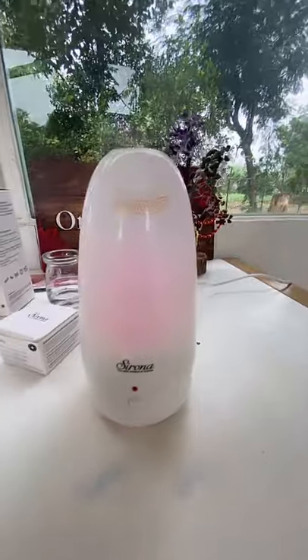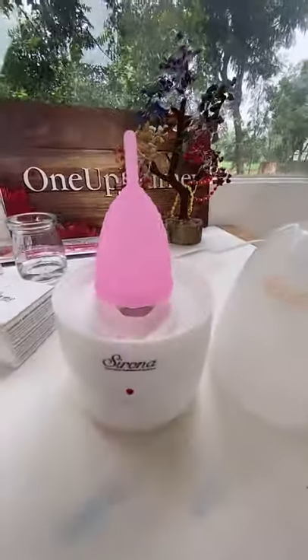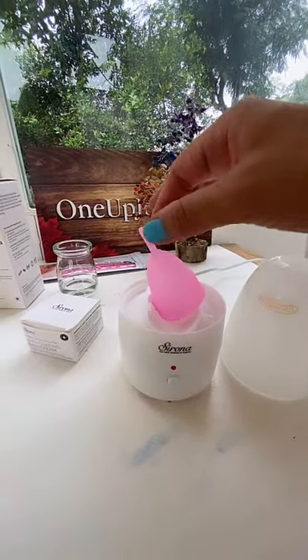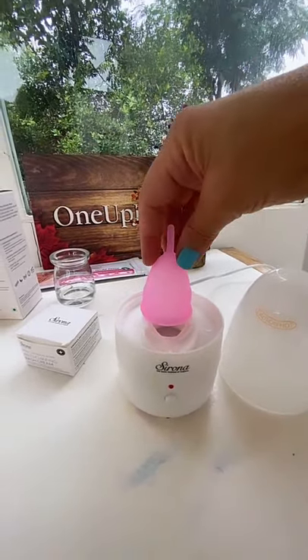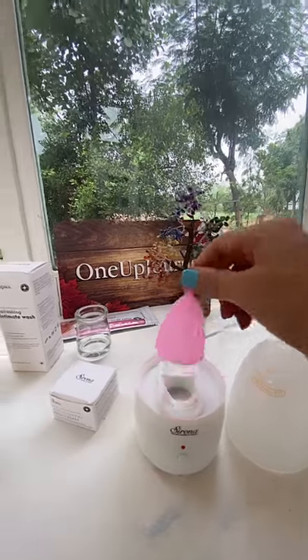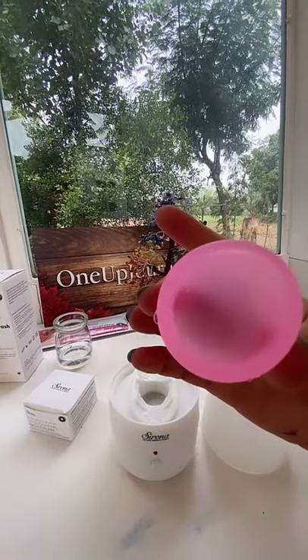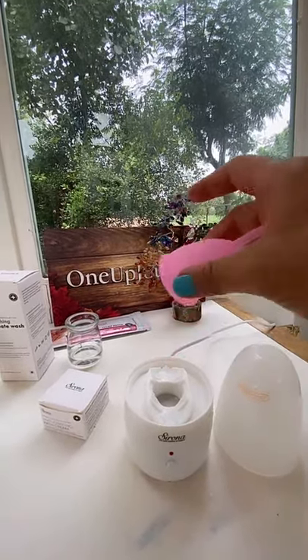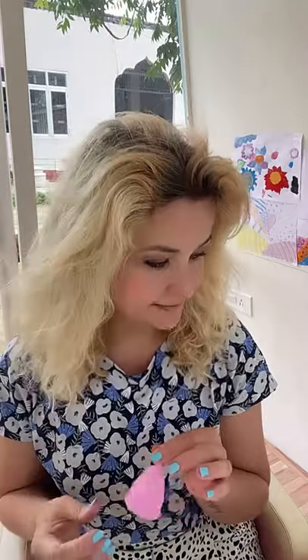The light went off — let me disconnect it from electricity. We open it and steam is coming — this is the perfectly sterilized cup. Be careful, it's going to be very hot. You can just leave it for a couple of minutes. Look — it's extremely clean, medical grade clean. All you have to do at that point is wait a little bit so you don't insert it when it's so hot.